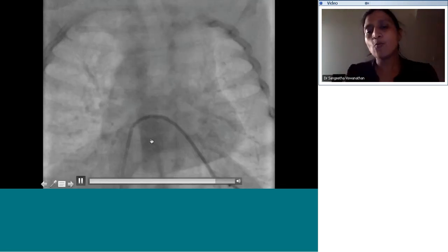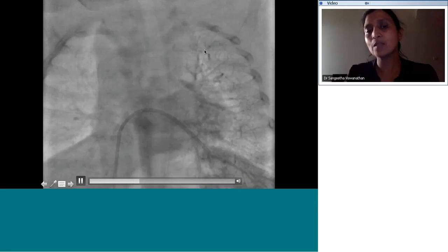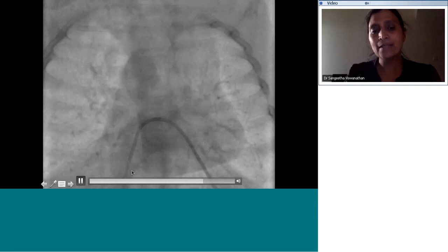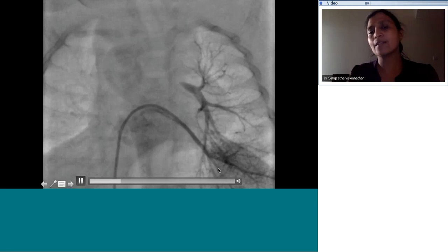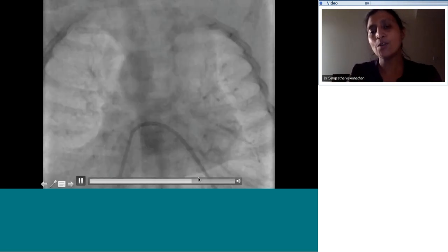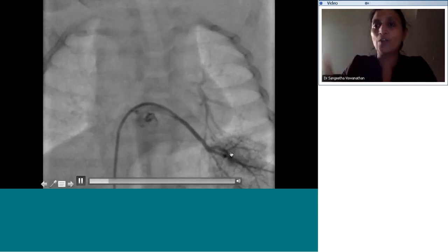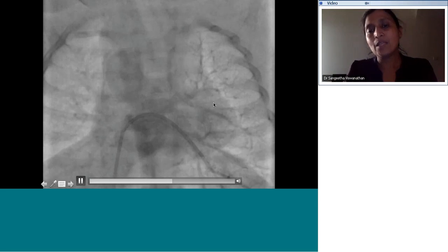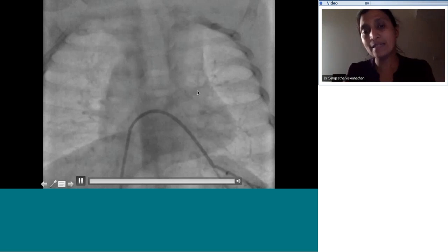So once again, what is this procedure being carried out? Yes, wide superior mediastinum. In this case, it is because of the thymus. Right. So IVC, RA, LA into pulmonary vein. So this is just like we discussed earlier, a reverse pulmonary venous wedge that is being carried out. And it's like I told you, the technique is layering of the contrast and saline. And you can see very nicely that the distal arborization of the left pulmonary artery is clearly seen.